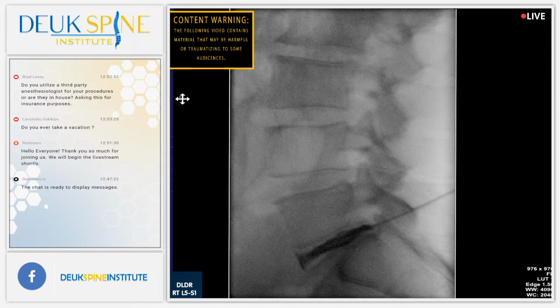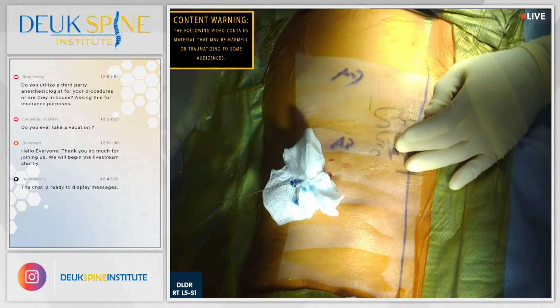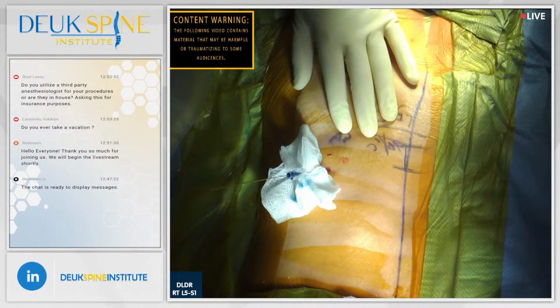We're also going to, you want to do some more num-num? We're going to treat his back pain as well as his leg symptoms. We're just giving you some numbing medicine.